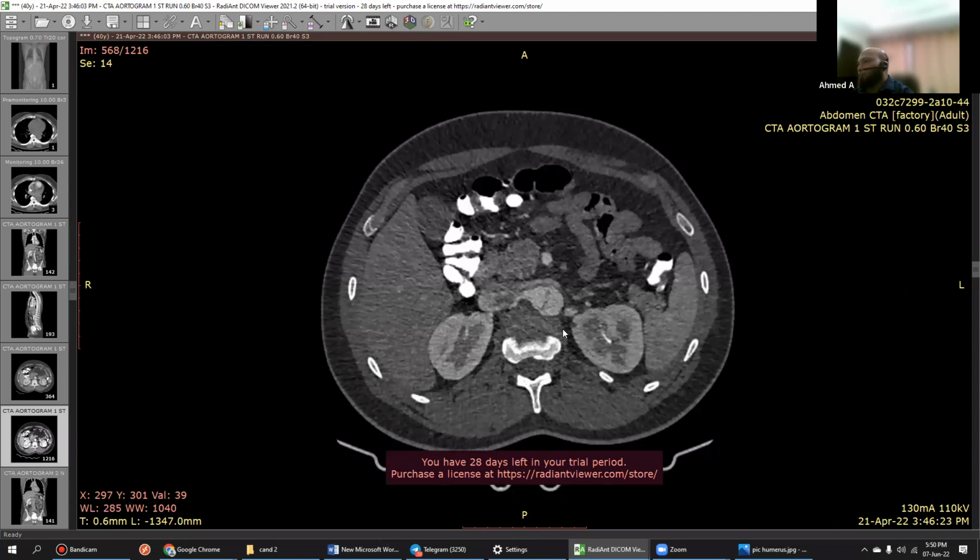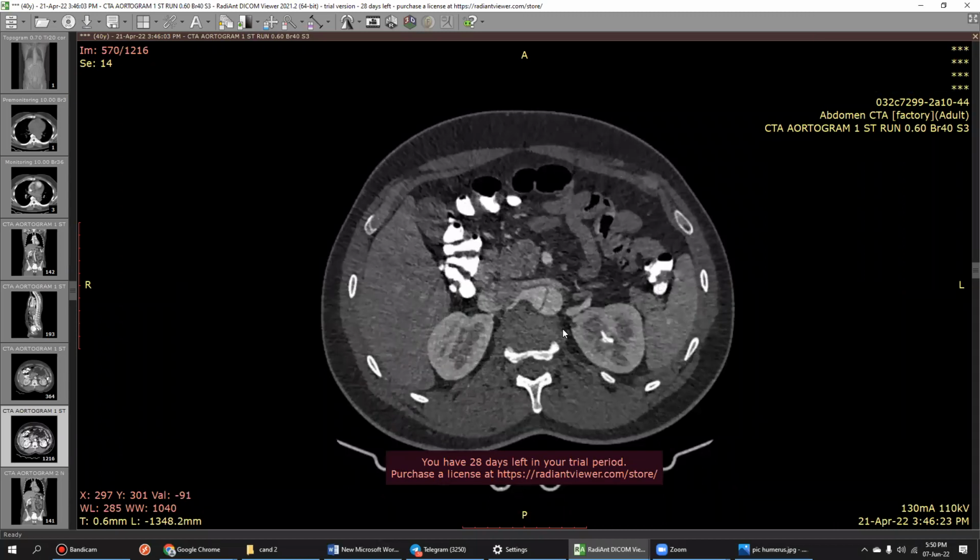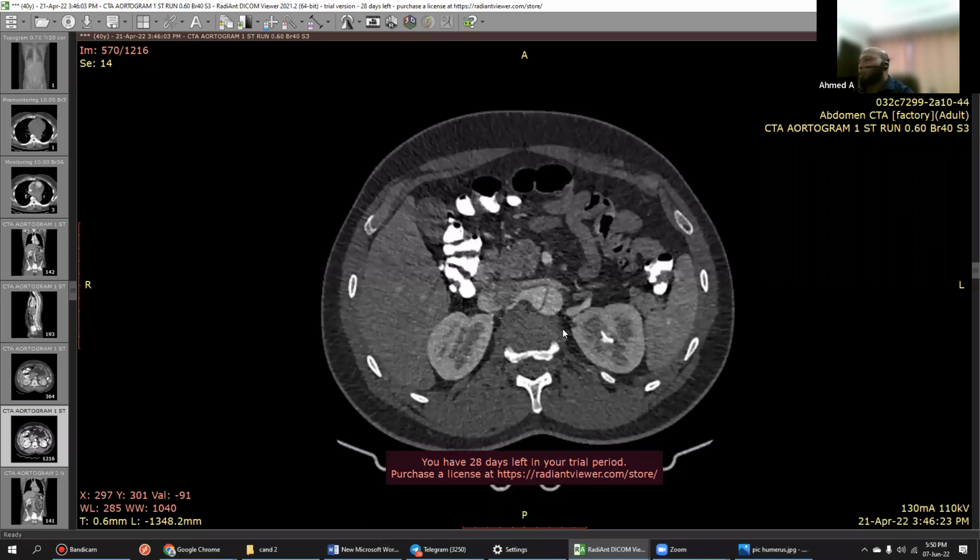Just for a tidbit of history, this patient was coming to the emergency every 2 or 3 months. He came 3 times in 8-9 months and was just referred like that. Then, just because he kept coming, they did a CT scan, and we had this finding. He's quite young, 40 years old, with no history of hypertension.